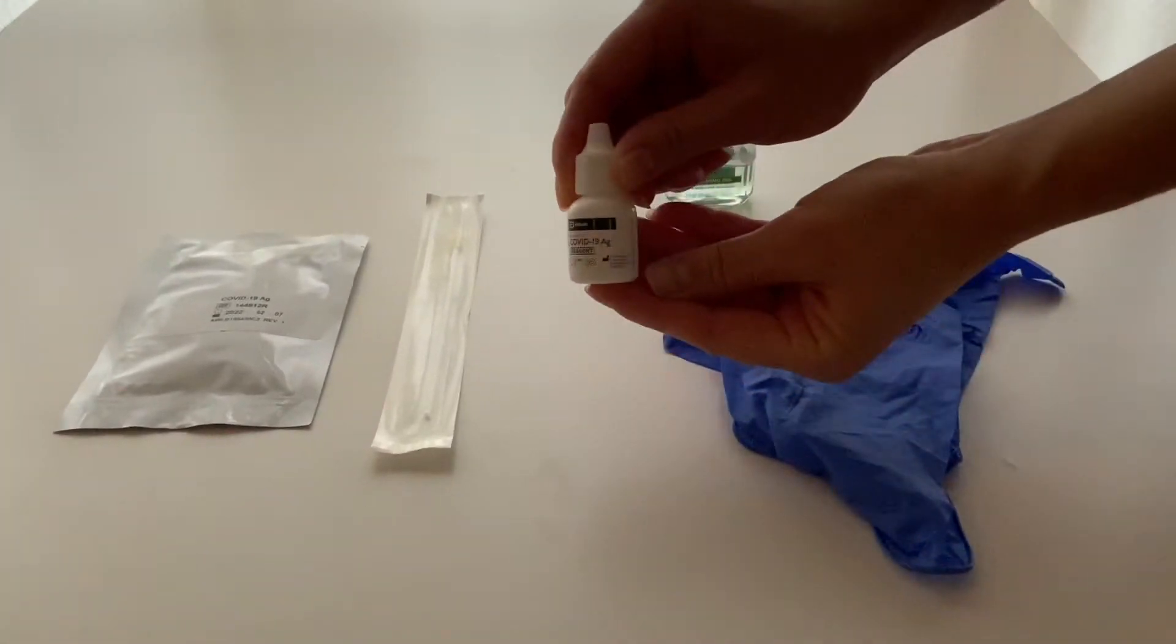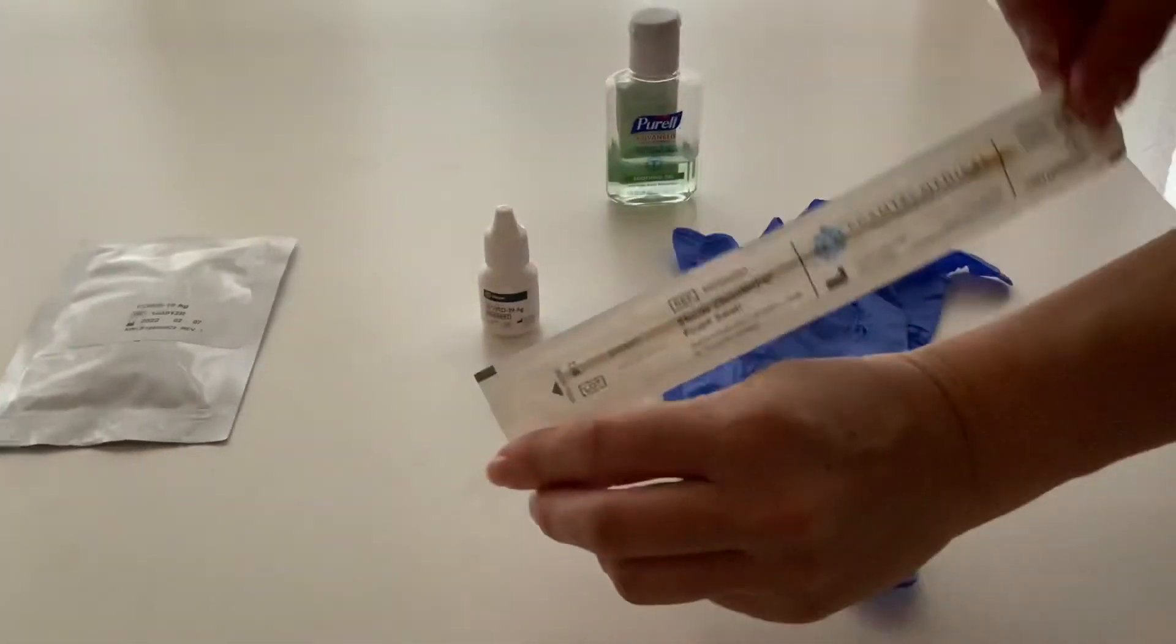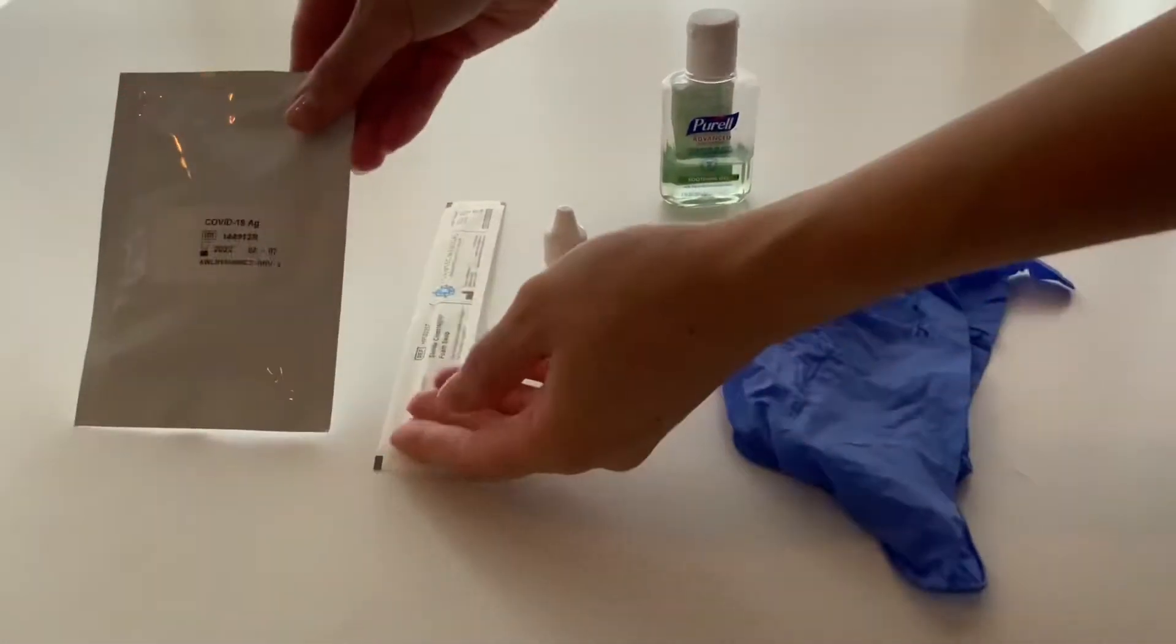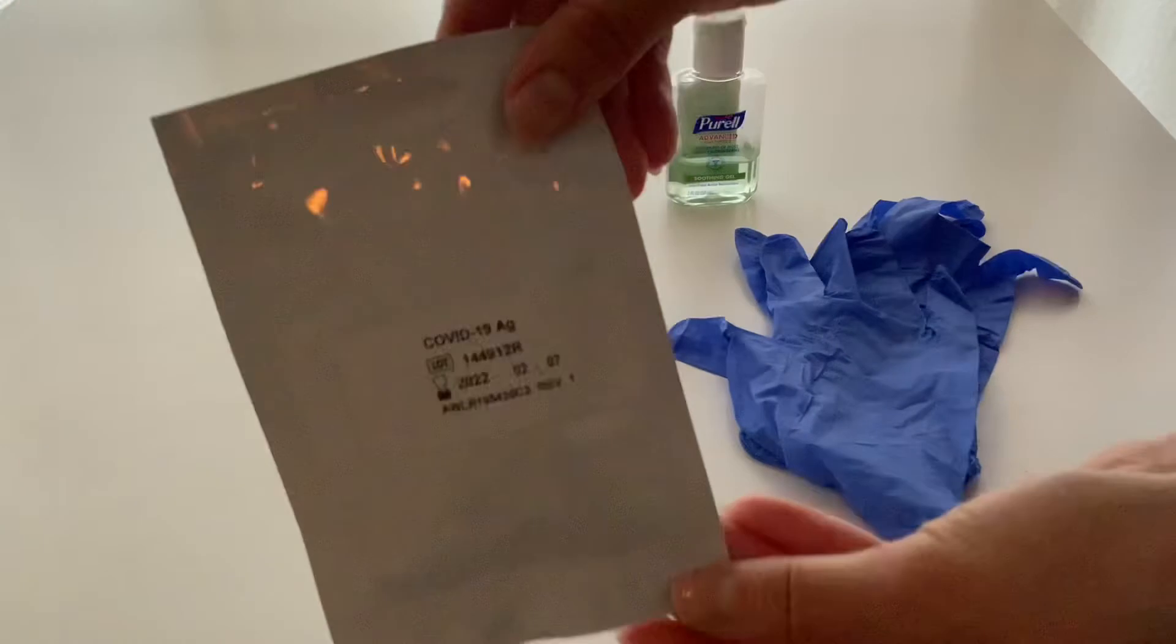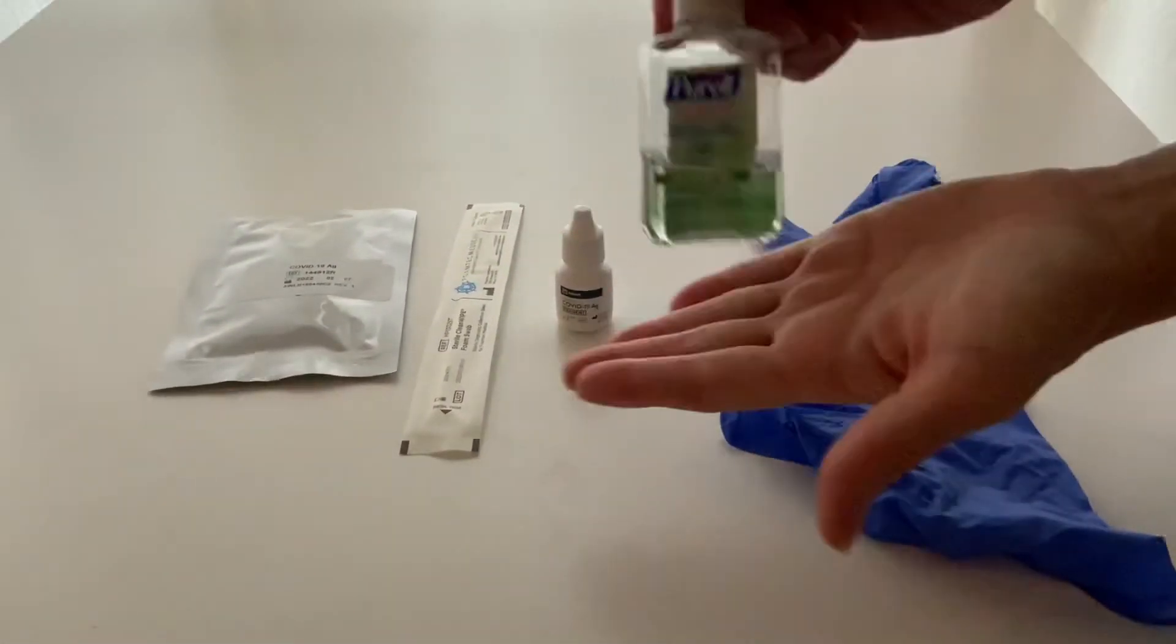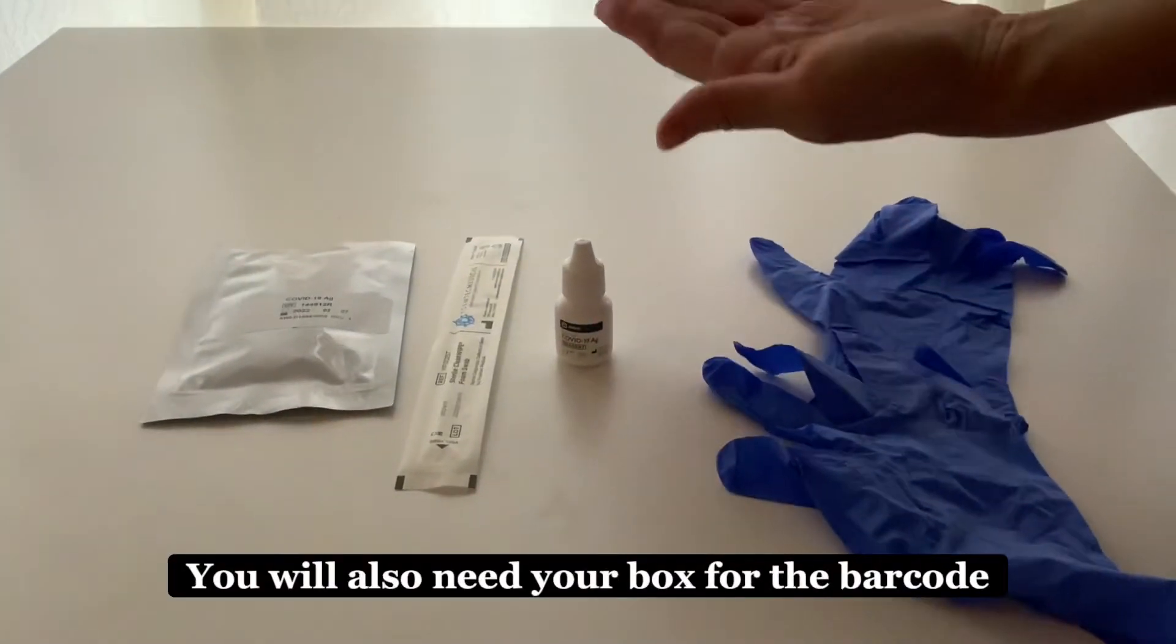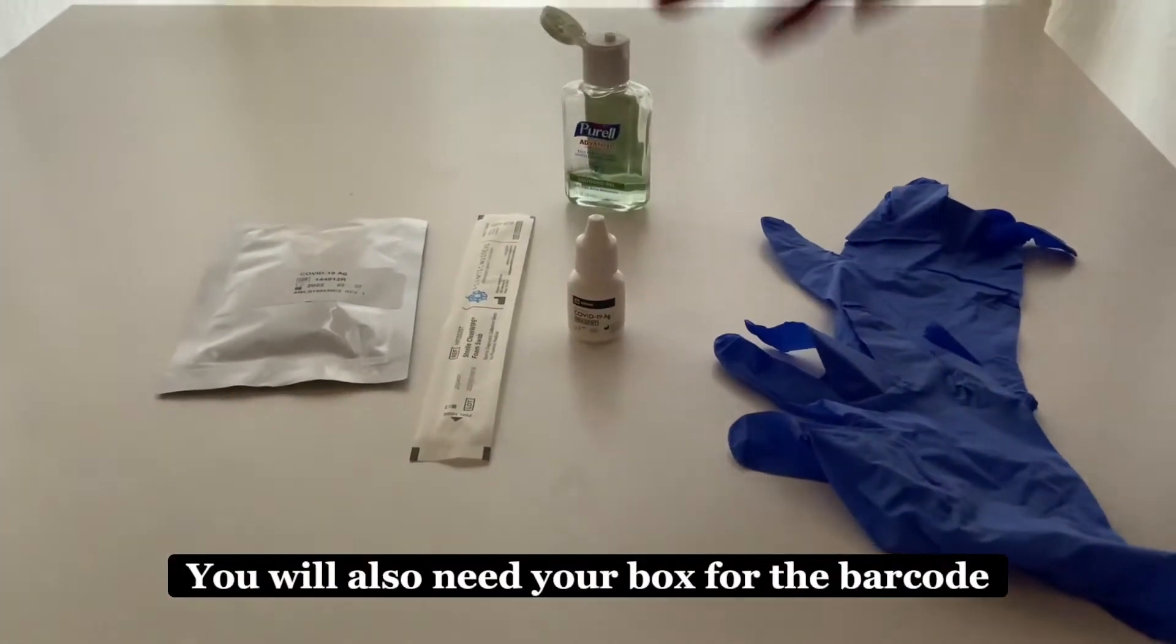These are the supplies you're going to need. You're going to need the solution that comes with it, also the q-tip that's pre-packaged, as well as the COVID-19 card. Don't open this card until you're quite ready to do the test. Also some gloves and some hand sanitizer. You will also need the box for the barcode. Don't forget you're going to need that box.